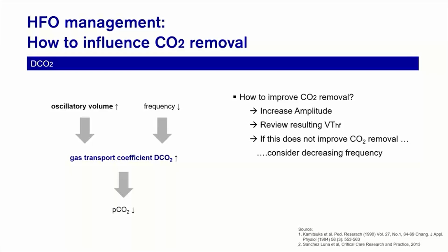Yes, but if I reduce the frequency, I give the ventilator much more time to deliver tidal volume. So the tidal volume in this case goes up, and as the tidal volume is in the formula to the power of 2, it overcompensates the loss of frequency and the DCO2 will increase. That's the reason why sometimes, if you can't increase the oscillatory tidal volume more, a reduction in frequency makes sense.